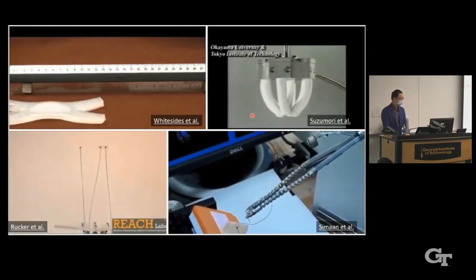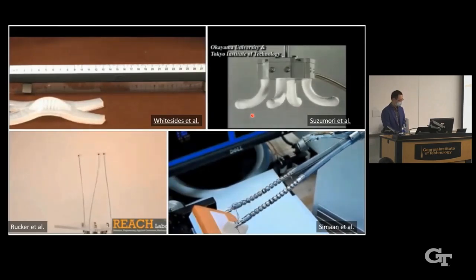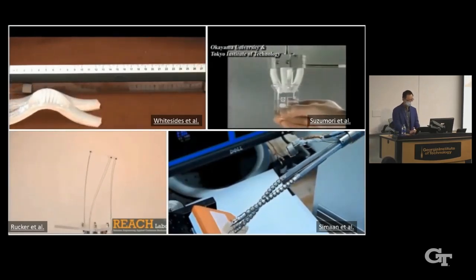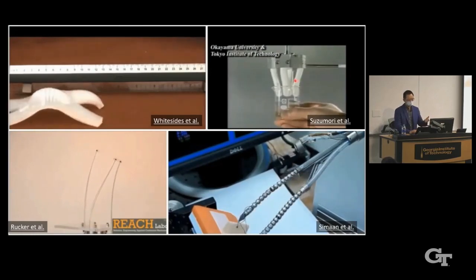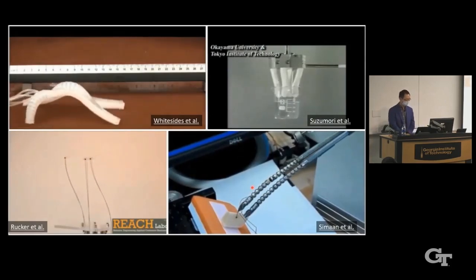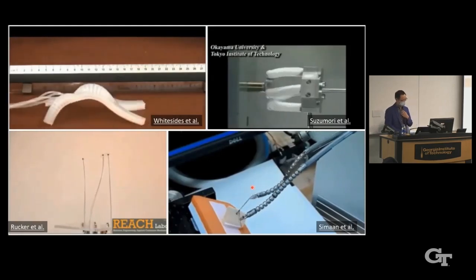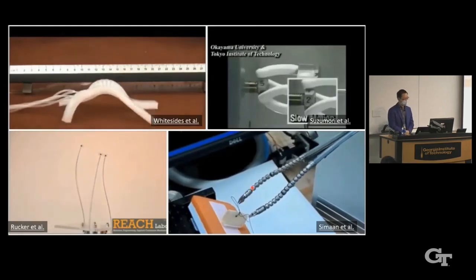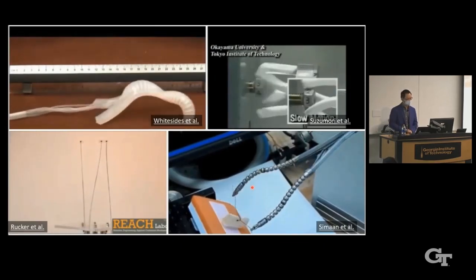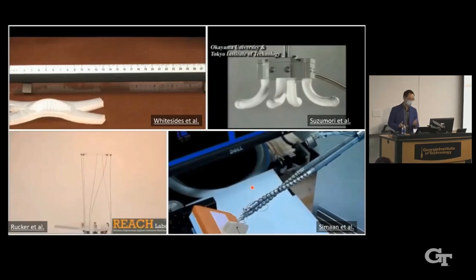Different continuum robots have been developed in the past probably 10 to 20 years. Here you can see a continuum robot that can be used for search and rescue. This is a continuum robot that can be used for grasping and even used to twist a screw. This is a continuum parallel robot, and this is a continuum robot for endoscopic procedures. Different from the conventional robot that is controlled by joints, the motion of the continuum robot is generated by the continuous deformation of the robot itself, because the robot is fabricated with continuously deformable materials like silicone or nitinol tubes.